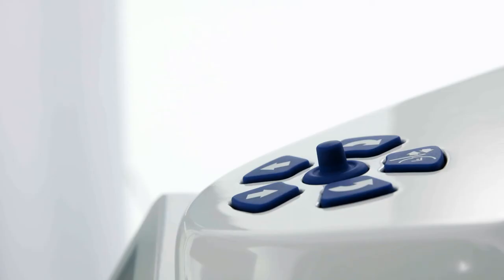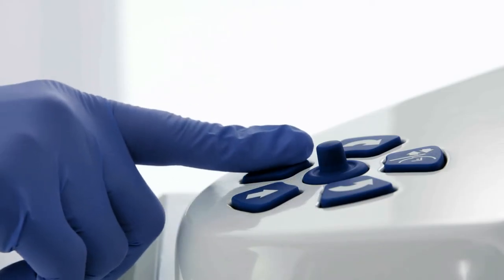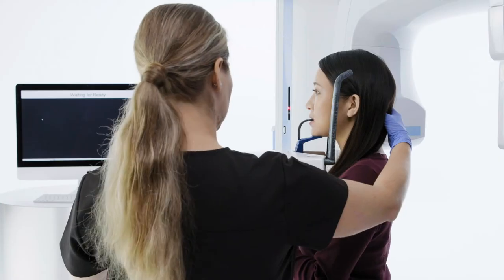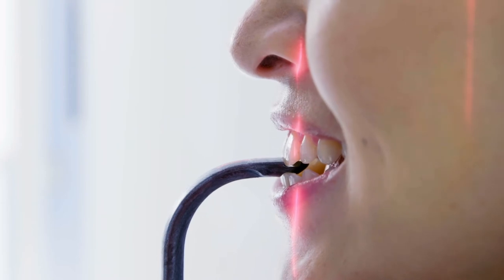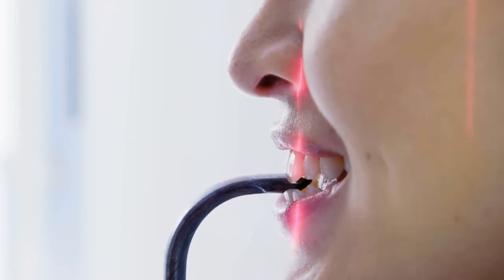To begin the positioning process, adjust the height of the unit until the chin rest is even with the patient's chin. Instruct the patient to bite on the bite stick and visually verify the upper and lower anterior teeth are in the grooves.